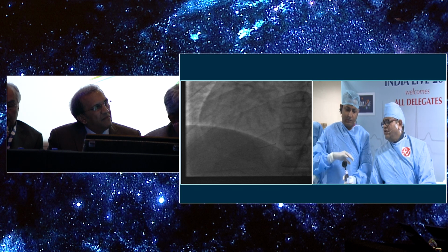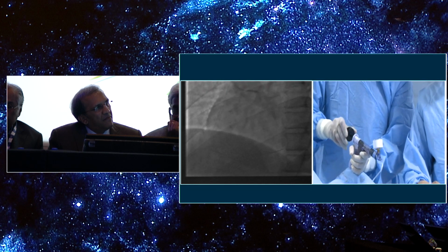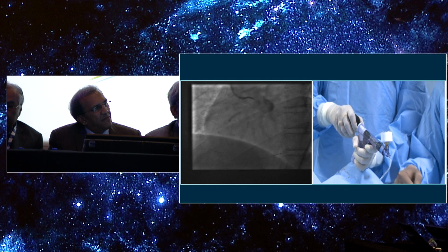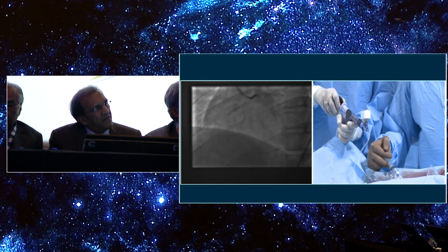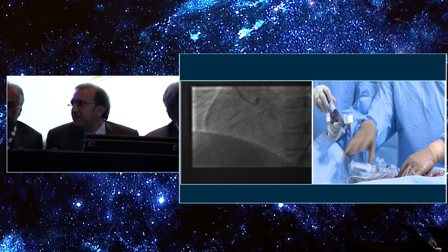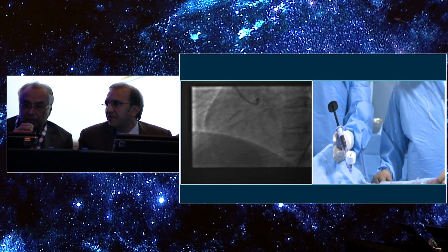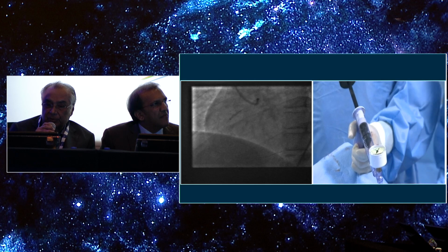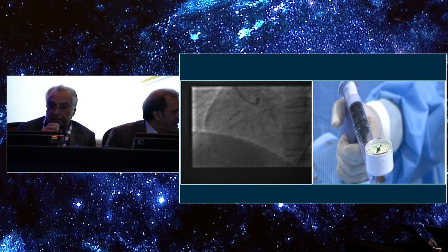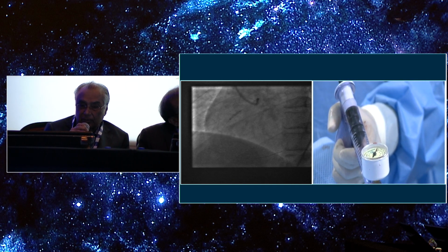So, can you inflate it? Vijay, you asked a question whether in a case like this one should use the femoral or the radial route. I would prefer in such a case a femoral route. The reason is many times you need a little longer or prolonged maneuvering, and easy maneuvering, which is much easier with the femoral route than with the radial route. So I would feel that going through the femoral route would be better in a case like this. That would be my preferred route.